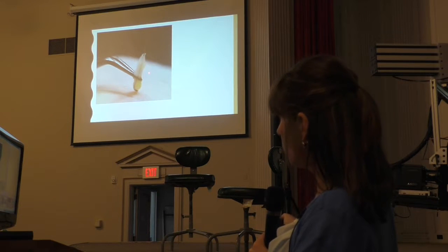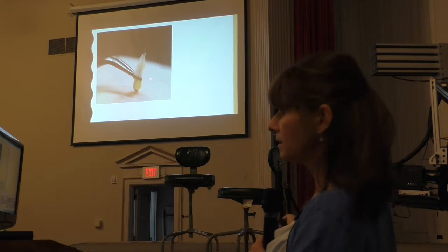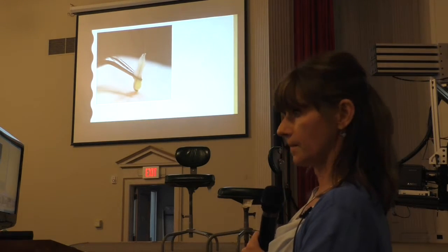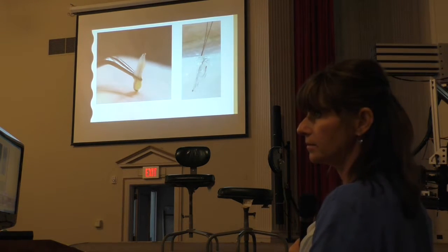What it does is it kind of folds in and bends. So the forceps should come like this, not like that. Does that make sense? Okay. Oh, there it is. So this is what it did.